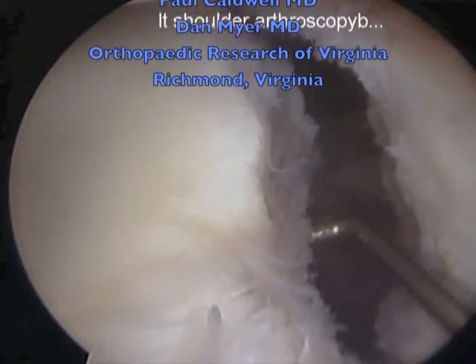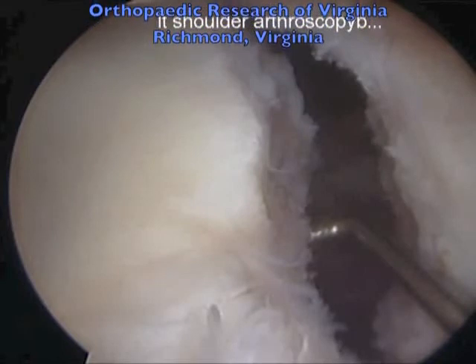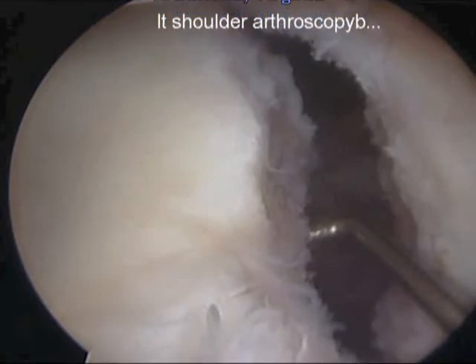We present our preferred technique for the management of bony Bankart lesions utilizing a transosseous repair.